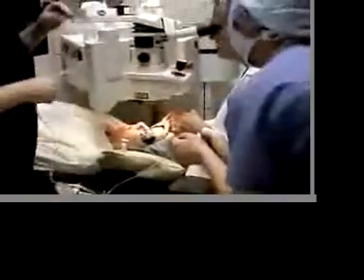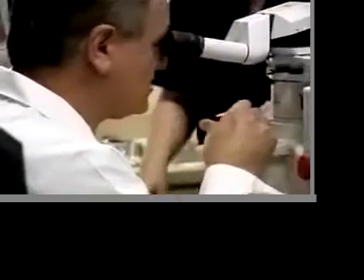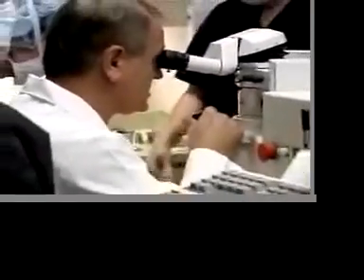And then after all that's been cleaned, we bring you into the laser room, lie you back, and then swing you under the laser, put a few little anesthetic drops in there so you don't feel anything. And then there's this little blinking red light in the microscope that you look at. I then look through the microscope down at your eye to make sure that everything's lined up just right. We then make the flap with the keratome, and we do the laser procedure, and the patient's only job is to look at that little blinking red light.